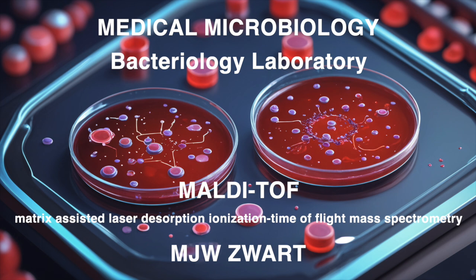What about cleaning the target plate? After it's been measured, that's got to be important too. Oh, you bet. They outline a very specific cleaning process. Ethanol, trifluoroacetic acid. TFA. Yeah, TFA. They even warn you, don't leave the plate in alcohol for too long. It could damage the magnet underneath. It's amazing how something so seemingly small can have such a big impact. It really does highlight how sensitive this technology is.